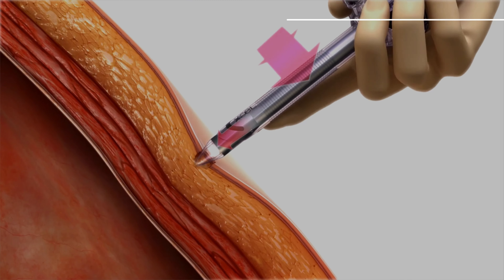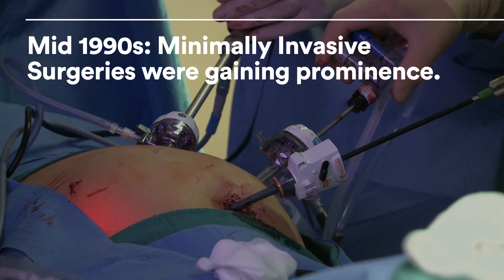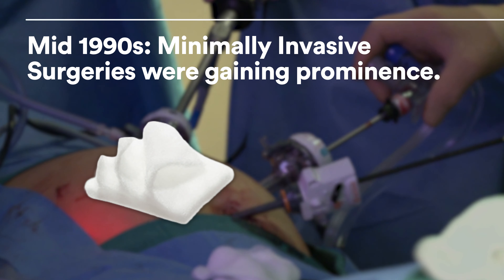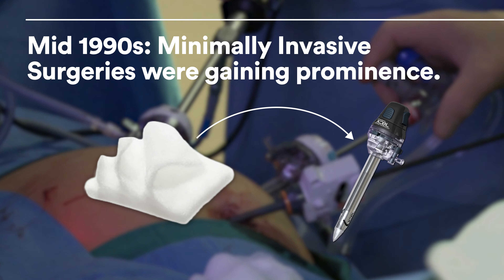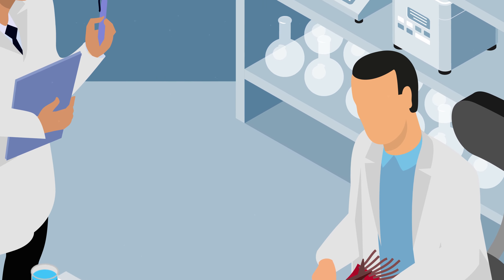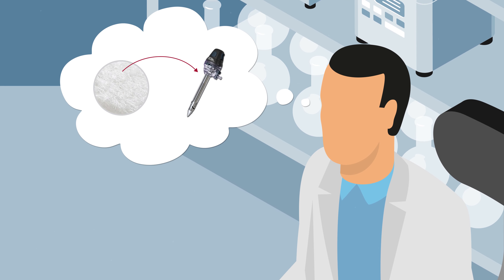In the mid-1990s, minimally invasive surgeries were gaining prominence across the world. When it came to hemostatic materials, a new lightweight malleable material was required that could be inserted through a trocar without falling apart. An Ethicon scientist with a knitting hobby discovered that the de-knitting process for scarves could be applied to surgical hemostats.